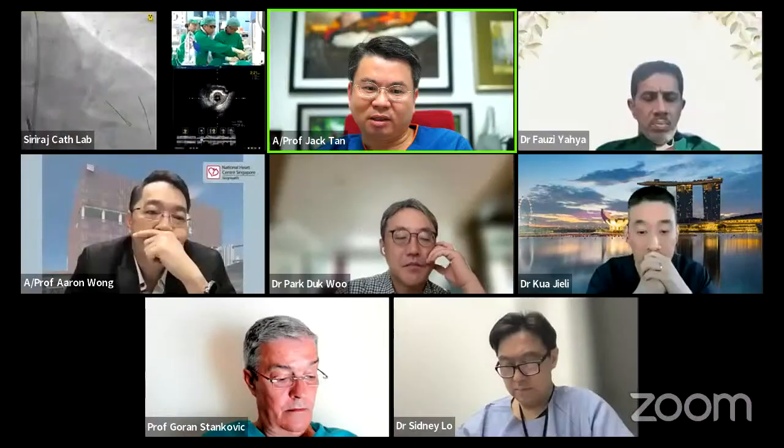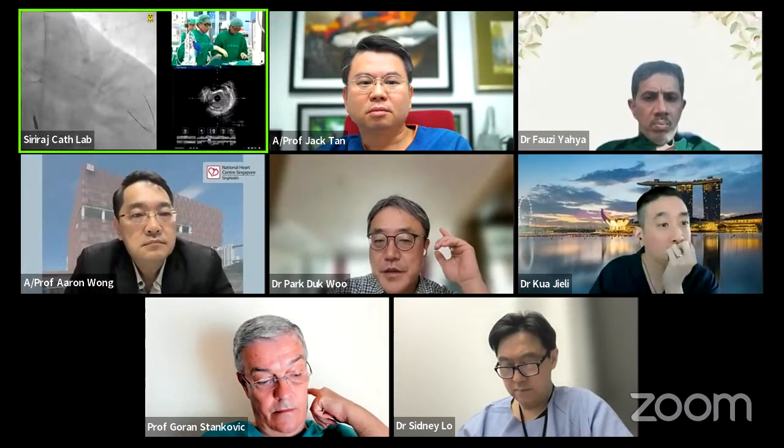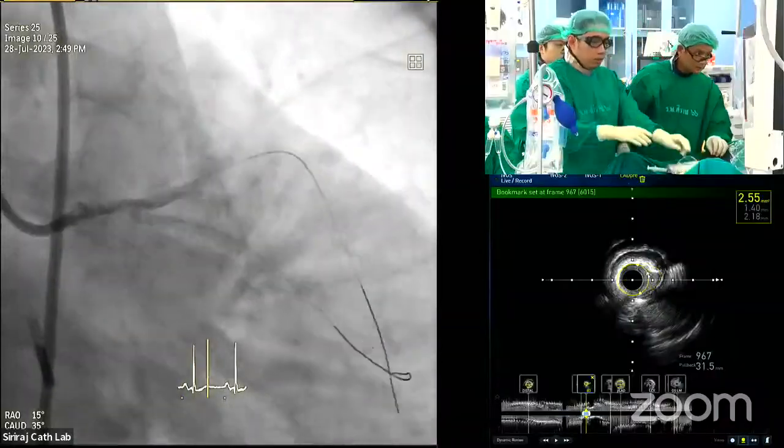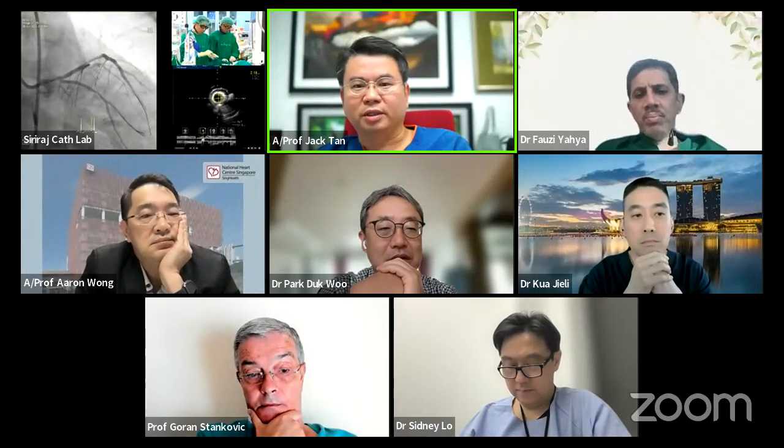Can I check back then with some of my panelists? DW, you saw the imaging. Initially you were thinking about bifurcation stenting, protecting the circumflex OM. Do you agree with this approach? Yes, I think the operator is now doing the pre-stenting, the lesion preparation. Have you already put the stent in the circ? Not yet? Yes, it's already stented in the circ, avoiding the ostium. On the basis of the IVUS, the circ ostium was involved. So if this patient were my case, I would do a crush technique. Okay, so you're going with a two-stent approach.